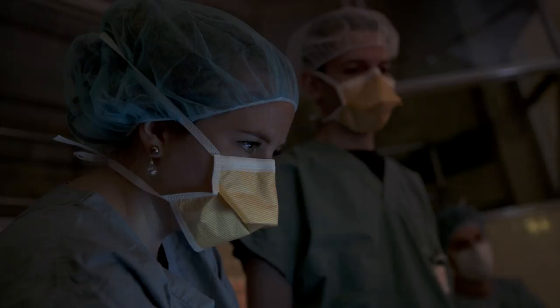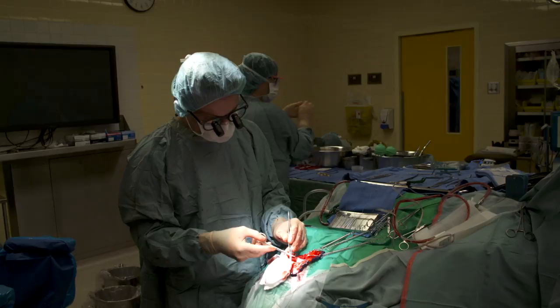Okay, ready? Interrogate. Go. Okay. Tumor. Thank you.